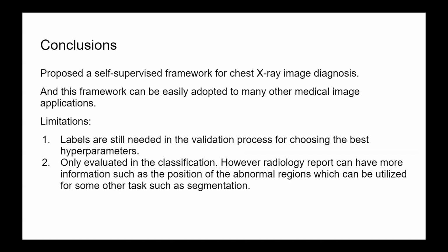So in conclusion, this paper proposed a self-supervised framework for chest X-ray image diagnosis. The advantage of this paper is that this framework can easily be adopted to many other medical image applications, because all these medical images will come with some kind of medical report. For example, for CT, they will also have a very sophisticated report as well. So this kind of label or annotation is always available. So their methods can be applied to a lot of other applications.